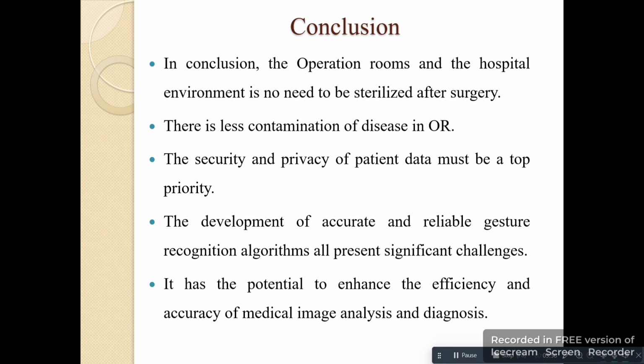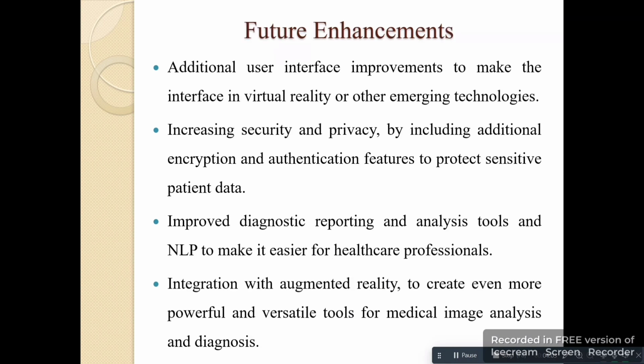The security and privacy of patient data must be a top priority. The development of accurate and reliable gesture recognition algorithms all present significant challenges. It has the potential to enhance the efficiency and accuracy of medical image analysis and diagnosis.